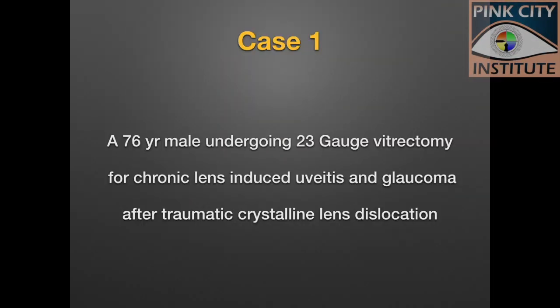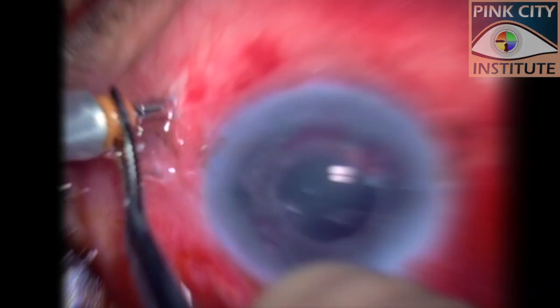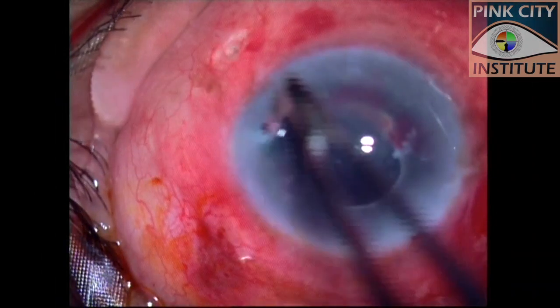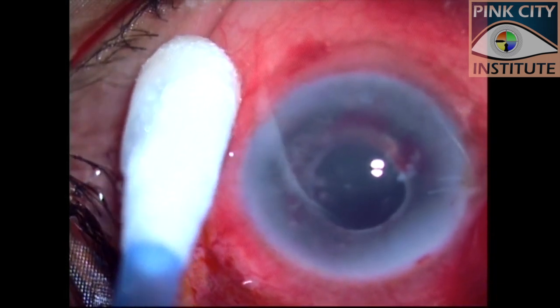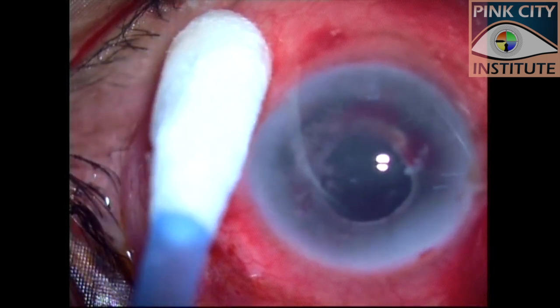Let us look at our first case, who required sutures for a leaky sclerotomy following 23-gauge vitrectomy for chronic lens-induced vitritis and glaucoma. In this case, the inferotemporal sclerotomy was leaking balanced salt solution despite massage.